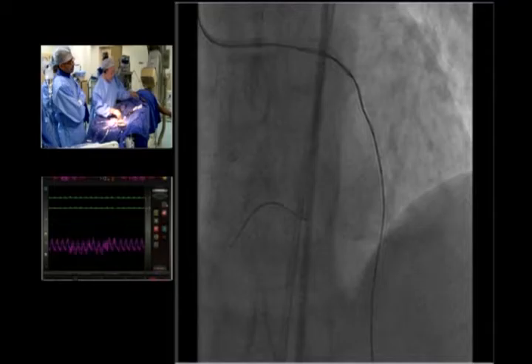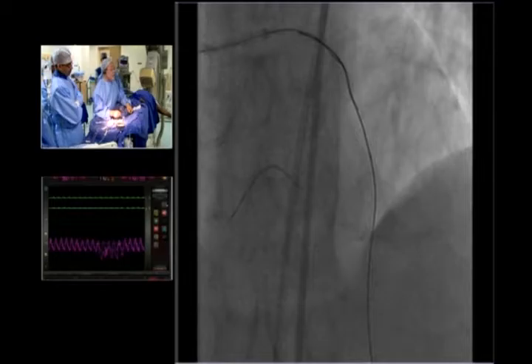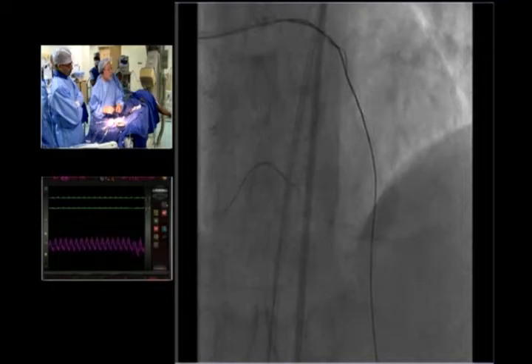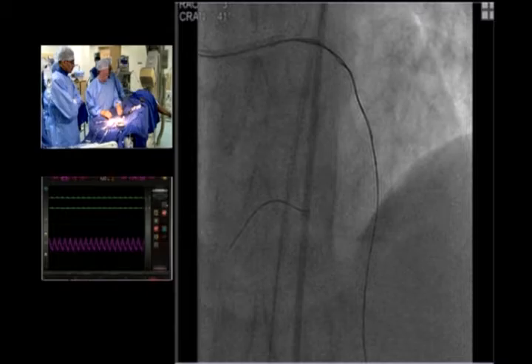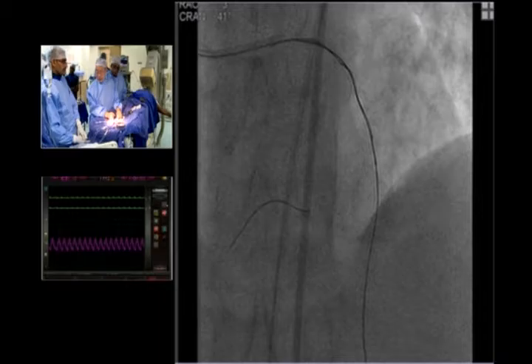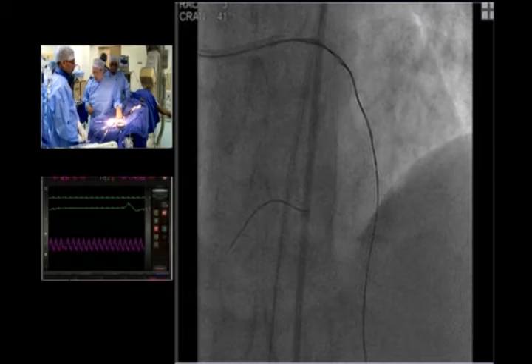One more option is maybe to remove the right catheter and put another left catheter, ping pong technique. You will have better support for the parallel wire and go with another guiding catheter with another wire with guide liner. Can you move the table? Okay, maybe it can definitely come back. I want to change the wire to a stiff one. Gaia 3rd. Gaia 3.